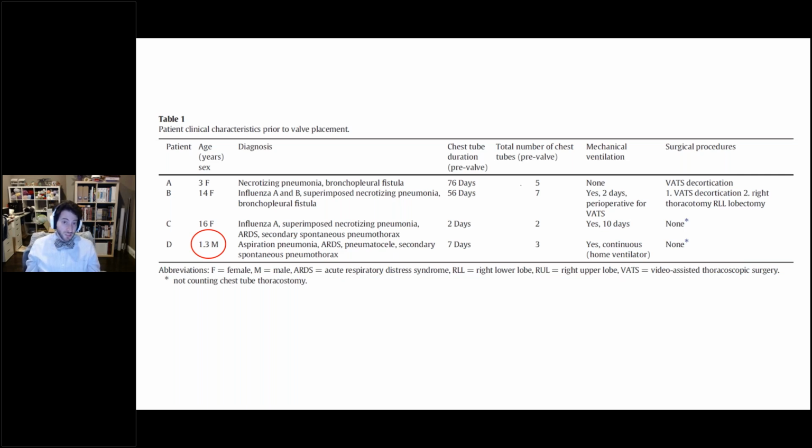This presented a unique challenge for her, and what she was able to do was she placed the bronchoscope and the deployment catheter alongside each other using forceps to help guide it into the position of interest. If you have any questions, she can go into this in much more detail, and it's very, very interesting.